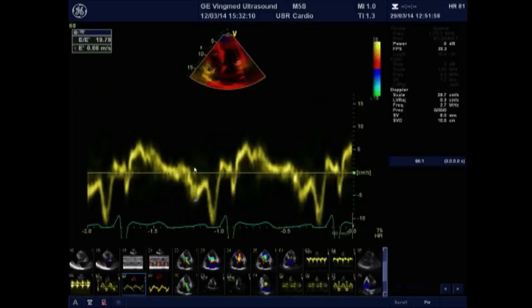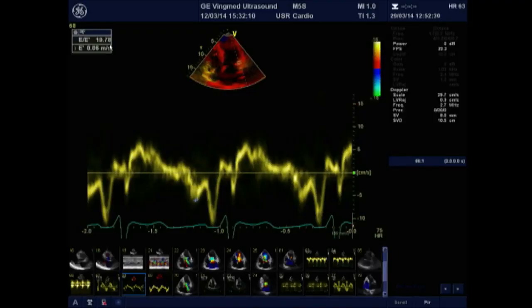When we move to Doppler myocardial imaging and you put the sample volume in the lateral site of the mitral annulus, we assess the early diastolic wave velocity, and we calculate the E to E prime, which is 19, almost 20. According to the ACVI guidelines, this ratio in hypertrophic cardiomyopathy suggests high left ventricular filling pressures if higher than 12 in these patients. So this pattern clearly points to high ventricular filling pressures.